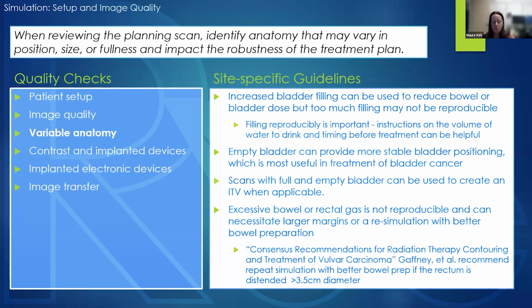An empty bladder can provide more stable bladder positioning, which is most useful if you're treating the bladder. That can help you to use smaller PTV margins because an empty bladder is much more reproducible. You may take scans with a full and empty bladder to create an ITV.